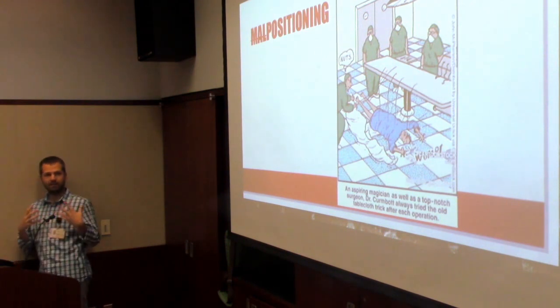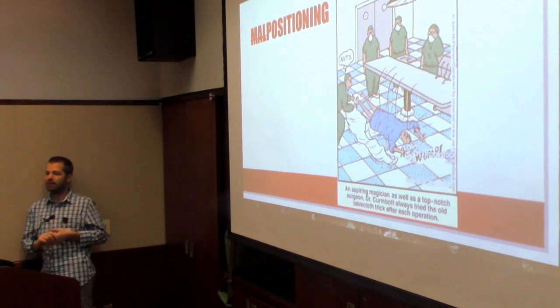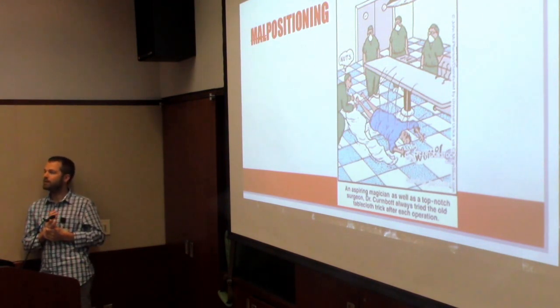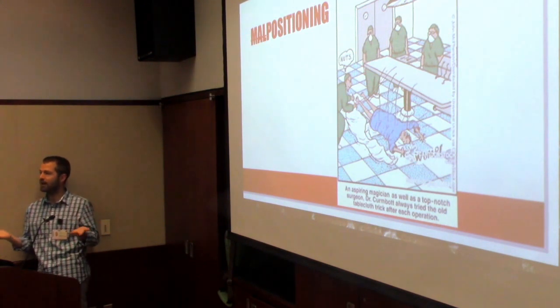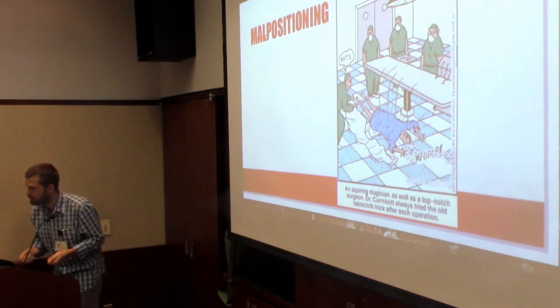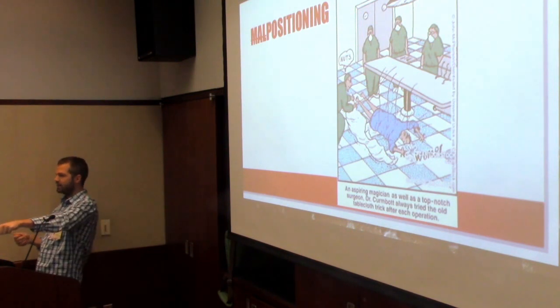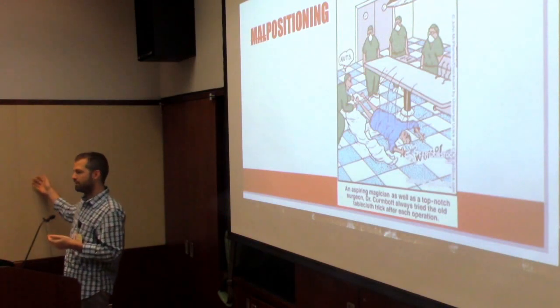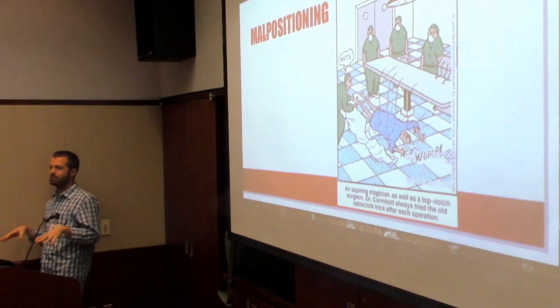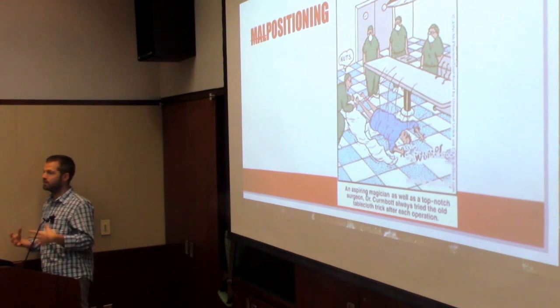And the last basic thing in preparation is positioning. If anyone's ever seen me put in an ultrasound-guided IV, I spend about 10 minutes setting up, but I also haven't missed in 60 patients. I spend about 10 minutes mostly just putting their body at a height where I'm super comfortable and very relaxed. So I'm not bending over, I'm not leaning back, I'm not doing left-handed lines if I don't have to, and I put a lot of padding under their arm. I lift their arm up. I make sure that everything is set up in a position so the person sits perfectly still, tolerates me taking my time, and isn't going to flail around once I do the initial stick.